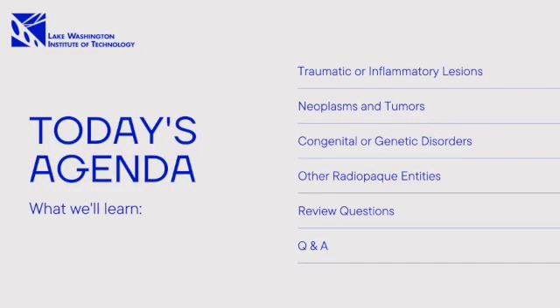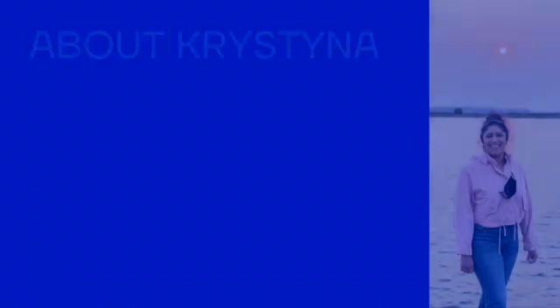On today's agenda, we'll be covering traumatic or inflammatory lesions, neoplasms and tumors, congenital or genetic disorders, and other radiopaque entities. Then we'll cover some review questions and have our Q&A session.